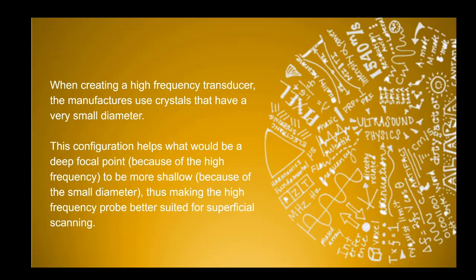Well, when manufacturers create high frequency probes, they're going to make the crystals itty bitty. They're going to make them super tiny. And remember, tiny diameters equal shallow focuses. So they counteract the fact that high frequency is going to have a deep focus by making an itty bitty diameter which will then decrease the focus of that beam.